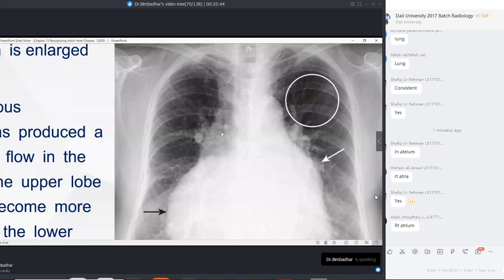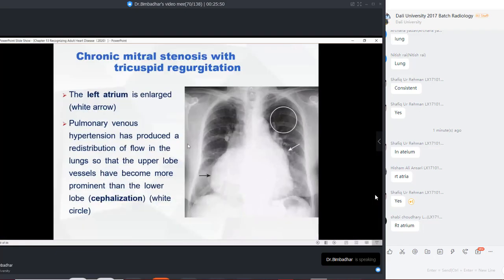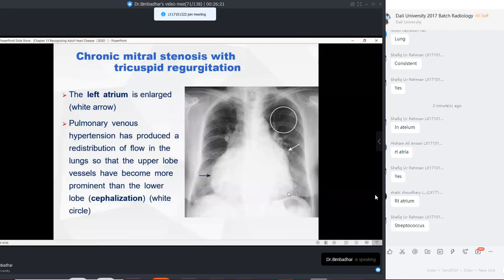And there is another peculiar finding I can see here. There is lymphadenopathy, which generally could have happened because of bacterial endocarditis and valve failures as well. Systemic infections, and most commonly nosocomial infections and pneumonias, will happen in these patients as well. So what is the most common cause for nosocomial pneumonias? Nosocomial pneumonias will happen, and that is the reason we find a lot of clinical conditions and appearances here.